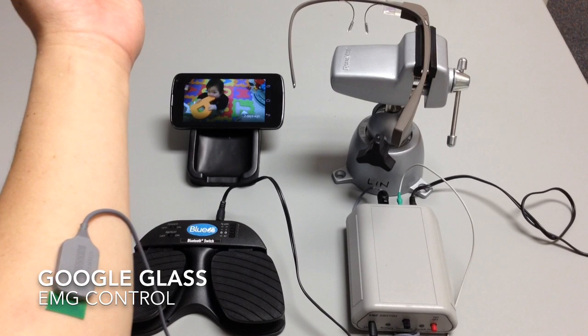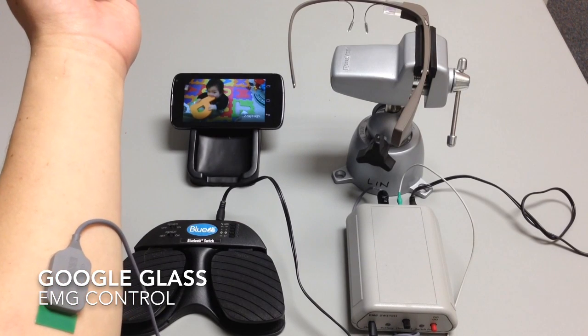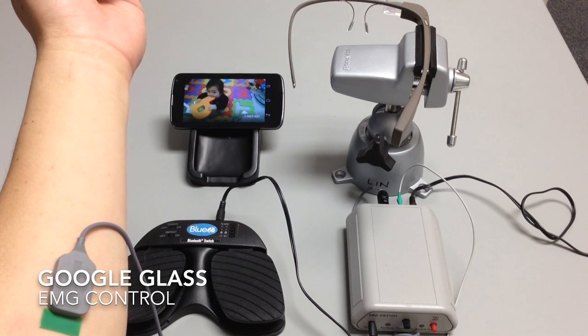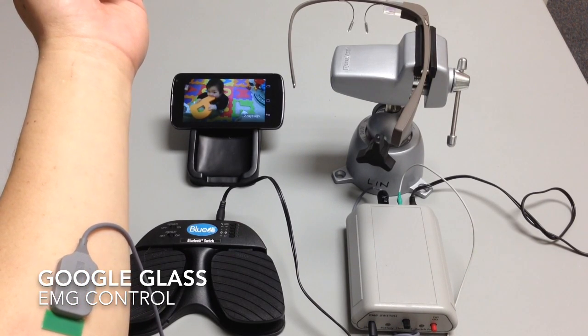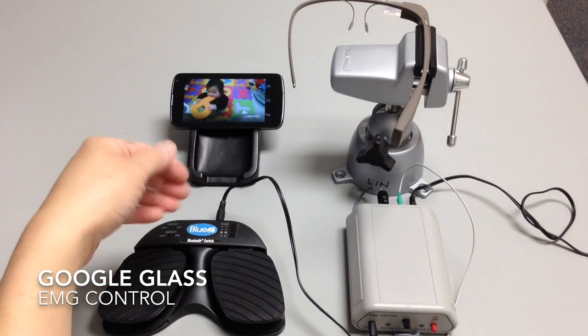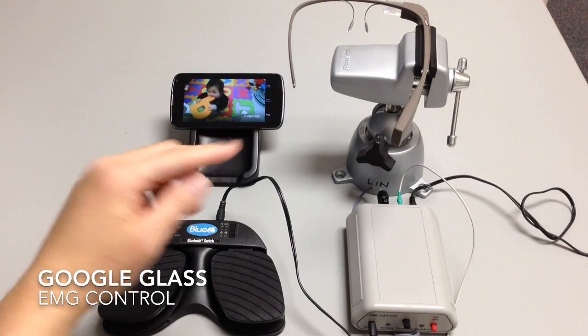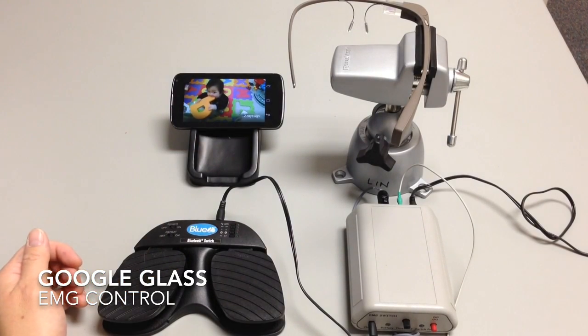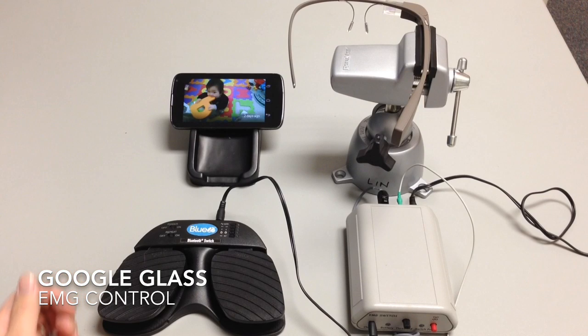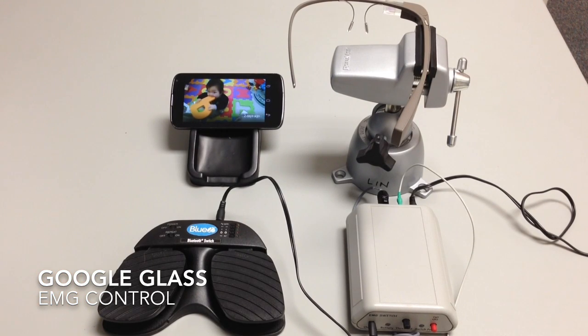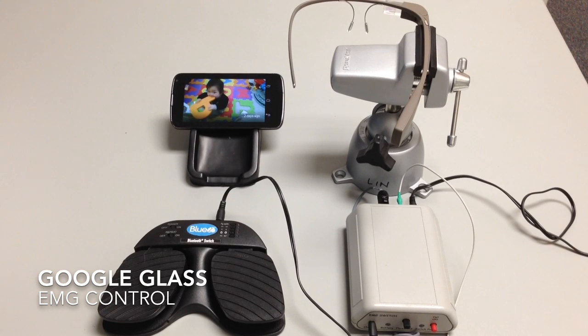So it's just a brief demo of how any kind of switch, including an EMG switch, could be attached to the Bluetooth switch and then interfaced with the Glass. The EMG switch could be positioned at the forehead or anywhere on the body.